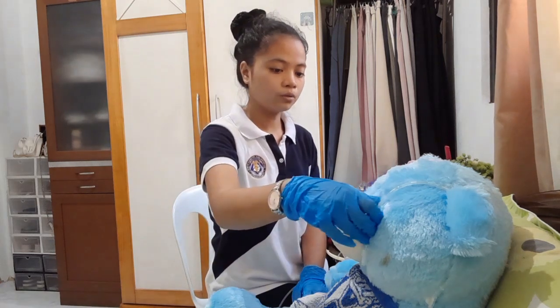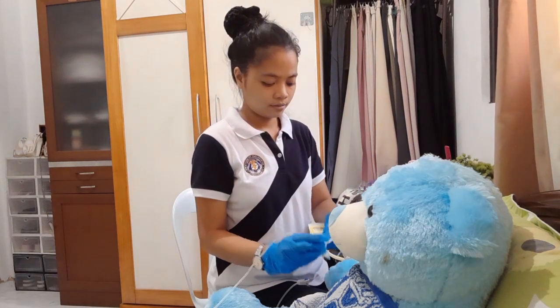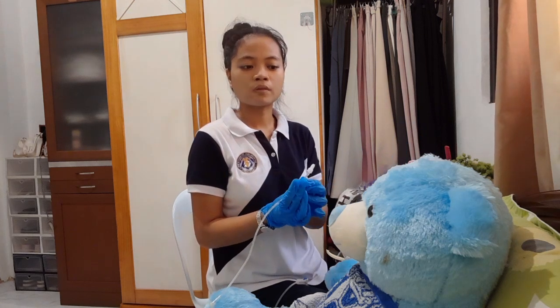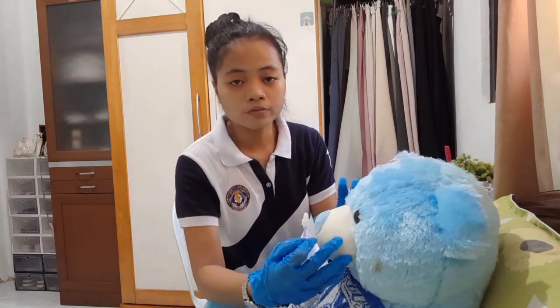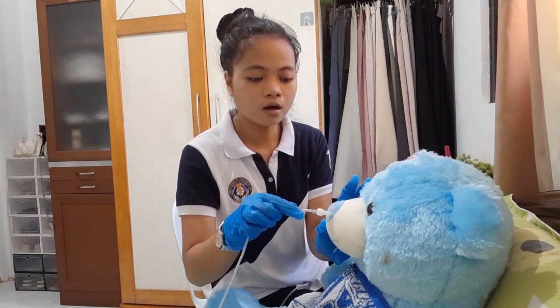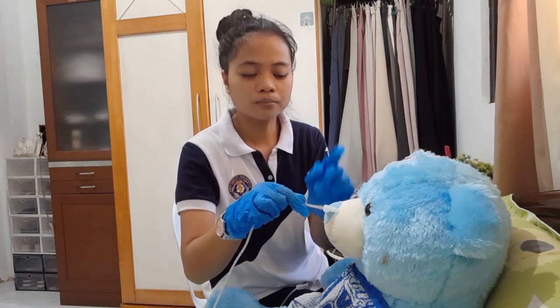Then we're going to lubricate the tube with water soluble lubricant. Lubricate. Then we're going to flex the client's head forward, tilt the tip of the nose upward, and pass the tube gently into the nose as far as the back of the throat, and guide the tube straight back.